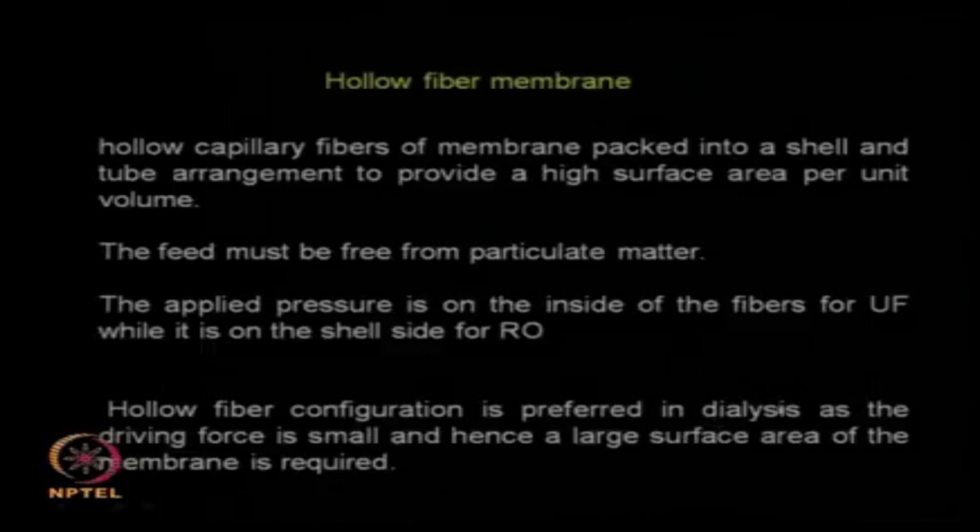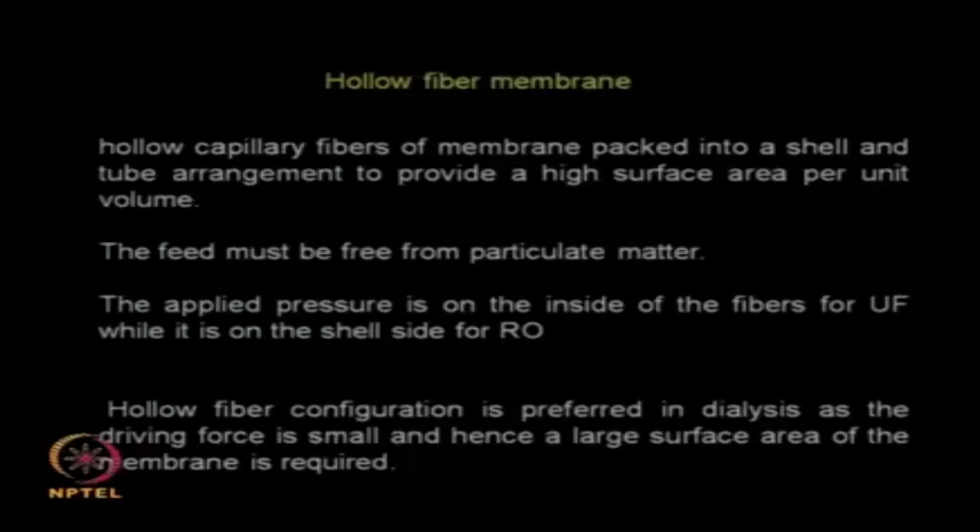Hollow fiber is preferred in dialysis because we are looking at very large surface area and we do not want to apply a big driving force, because we are dealing with the human system, so the driving force is not large like at industrial scale. The other way of increasing your flow rate or filtration rate is to increase the surface area. So hollow fibers are preferred in such a situation.